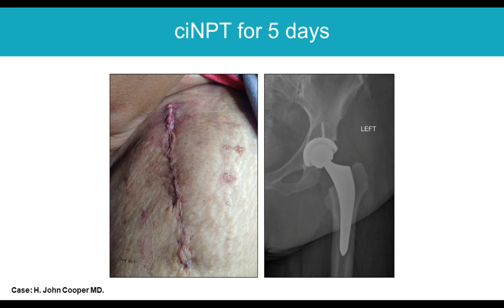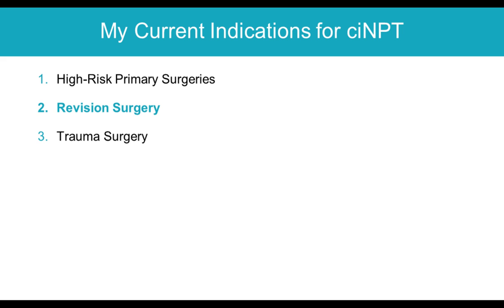So this is a patient who was treated with a negative pressure dressing for 5 days. When it came off, you can see how beautifully her incision is healed with no incisional complications. Toward the bottom of her incision, there is already mature-looking wound healing. At the top, there's a little bit of puckering of the incision, but no drainage, no surgical dehiscence, and she healed uneventfully.